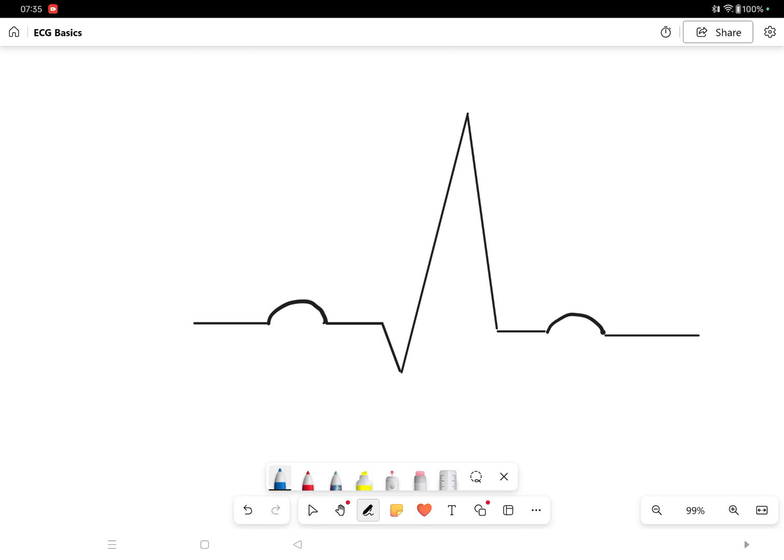Second thing to appreciate, really important, I would say, is that the ECG represents a three-dimensional structure of the heart. Essentially, it gives you a full 3D view, a 360 view of what the heart is doing, in which direction it's pumping, when it's pumping, if there's a bit of a tilt in that pump relative to its axis, etc.